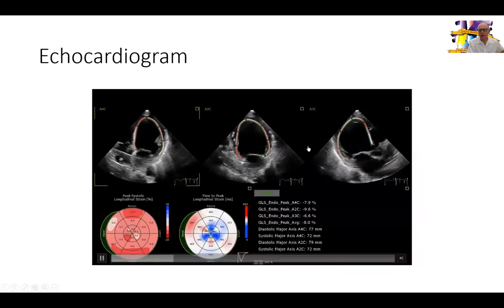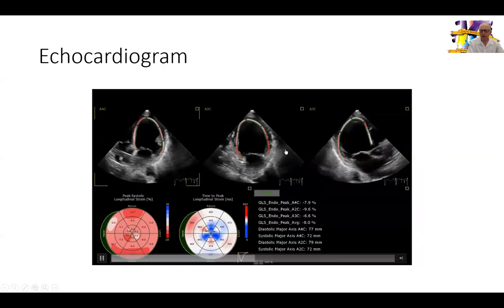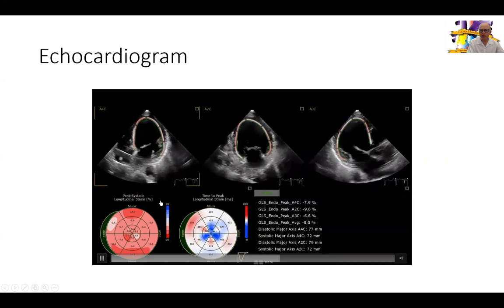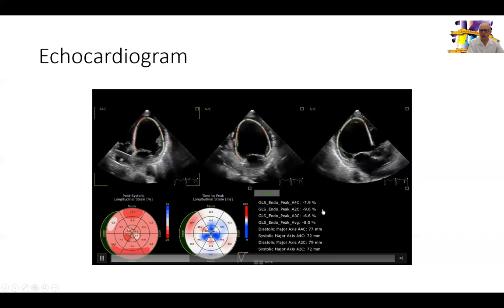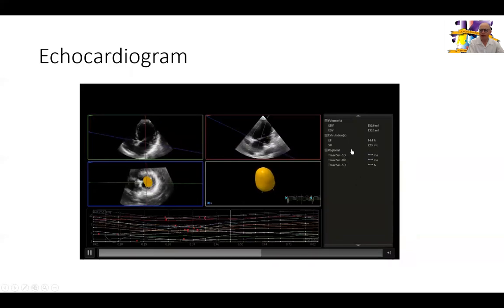She had an echocardiogram before she presented to us. You can see global left ventricular dysfunction, significant reduction in ejection fraction, left ventricular dilatation, and dyssynchrony with global reduction in longitudinal strain across all segments. Ejection fraction was calculated by 3D echo at 14.4%, with a very dilated ventricle and very large end-systolic and diastolic volumes.